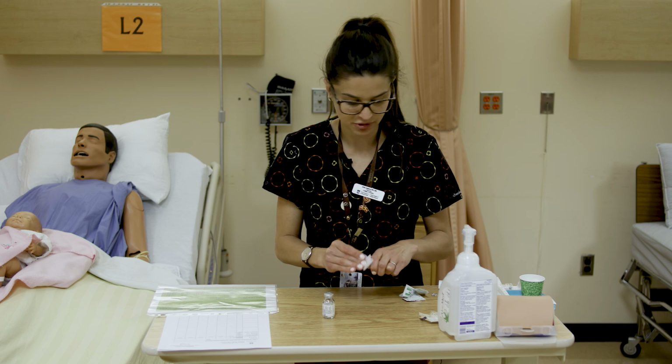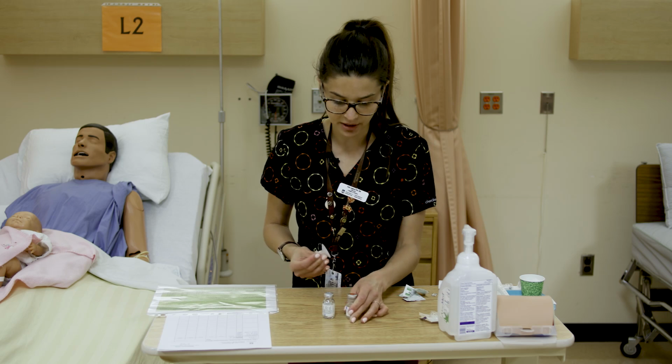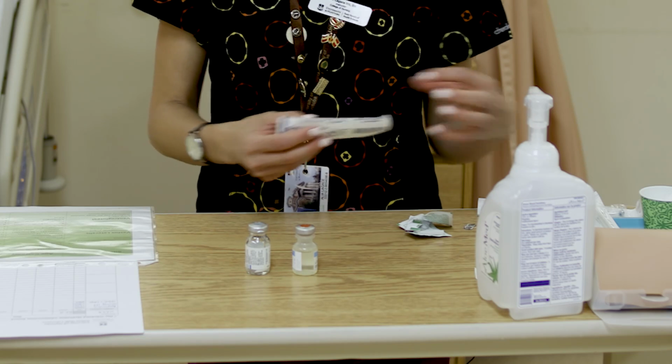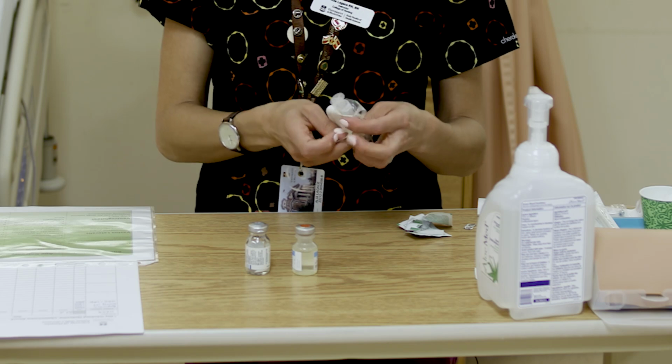So we'll clean these and let them dry, and then while they're drying, we'll get our syringe ready. So to draw up the 3.5, we are going to use a 5 mL syringe. You just need a syringe that's obviously greater than the 3.5. So we're going to open it similarly to our others.